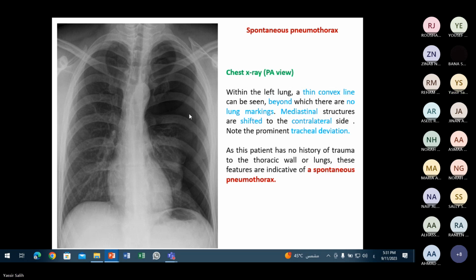Where is it? In the lung. In the pleural cavity. Yes. So what is this structure? Do you see it? Lung. This is the lung. What happened to it? Compressed, decreased volume. Why is it compressed? Because if we follow here, this is the visceral pleura.